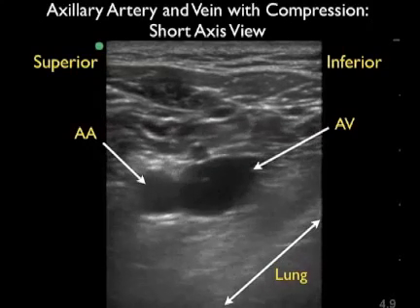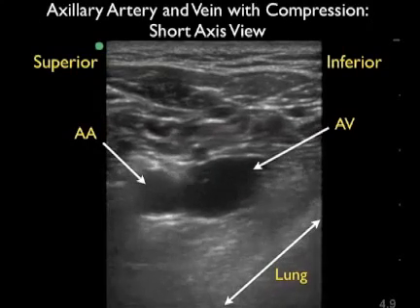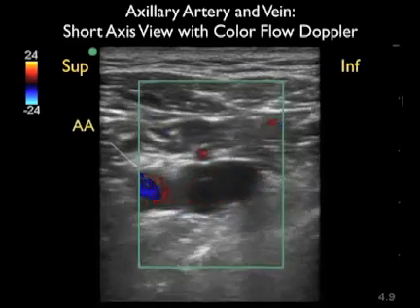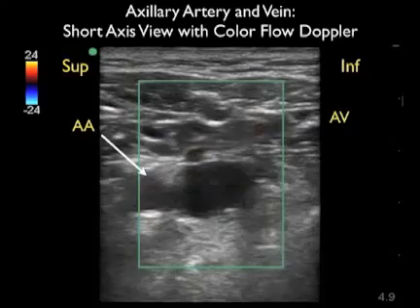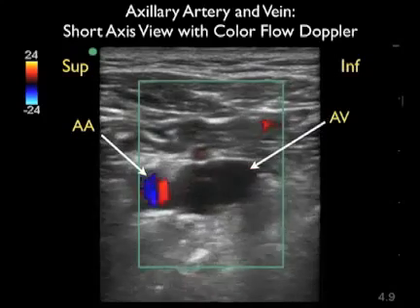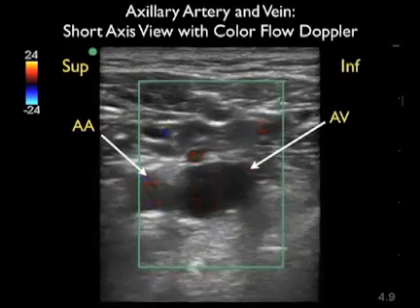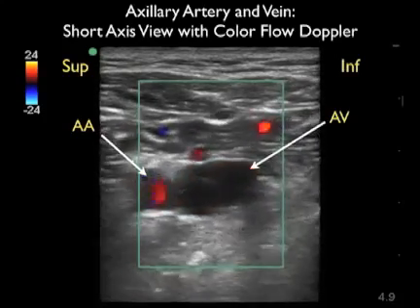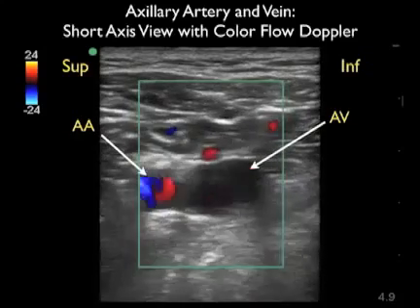We can see the lungs sliding towards the deeper aspect of the image. In this ultrasound image, again taken from a short axis configuration, we'll use color flow Doppler to further differentiate the axillary artery from the axillary vein. We note again that superior is to the left and inferior is to the right, and we can see the smaller axillary artery with pulsations indicating arterial flow within the lumen.